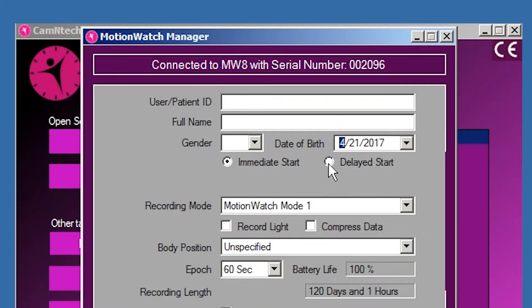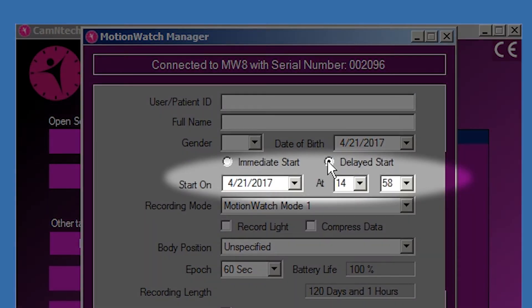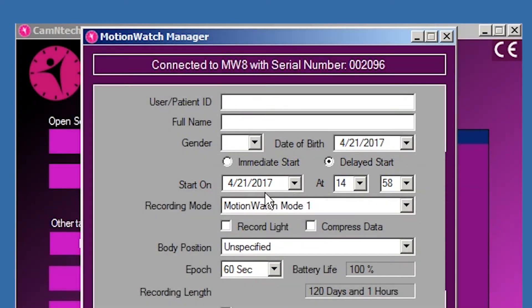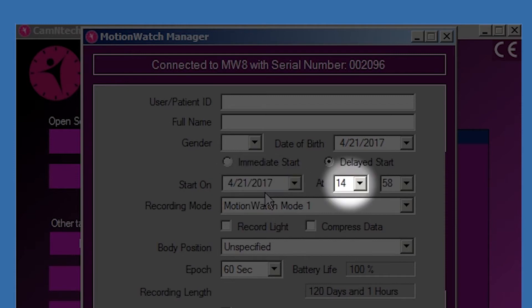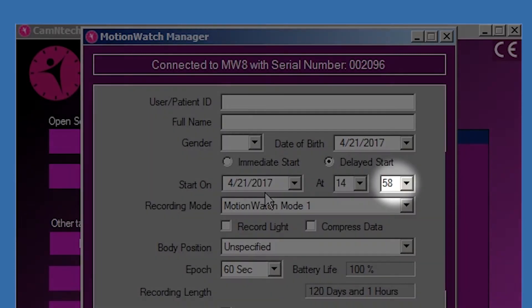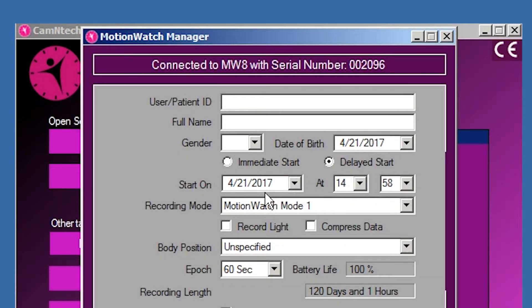Select Delayed Start to show the start date/time controls. This option allows the recording to be delayed for up to 30 days into the future. Use the date, hours and minutes controls to select the required start date and time.